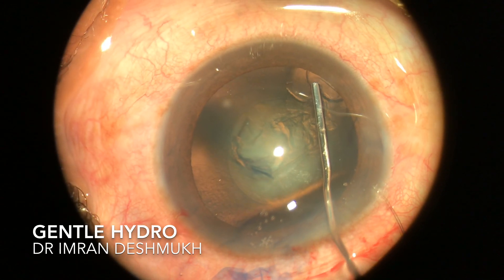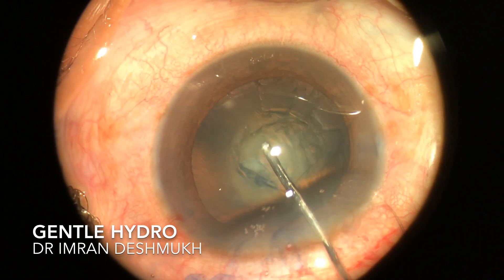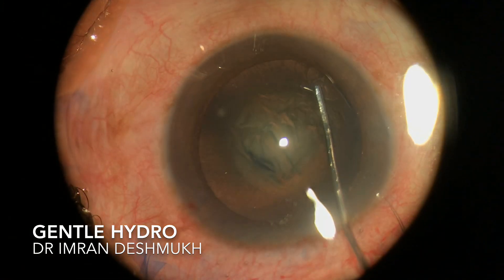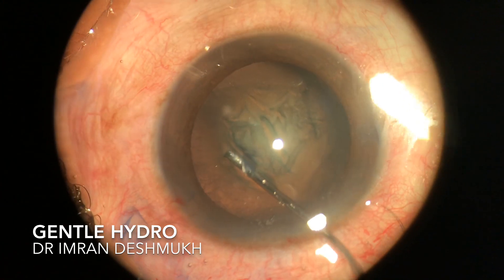Gently do hydro dissection, then come to the center and press on the nucleus so that the extra fluid comes out to the periphery. Make sure you watch the wave, then go in the opposite direction.